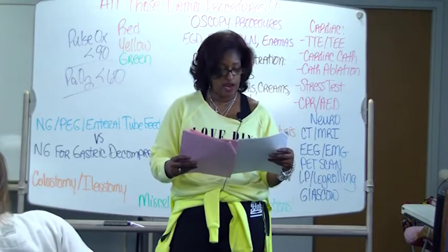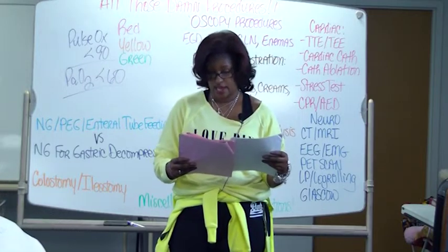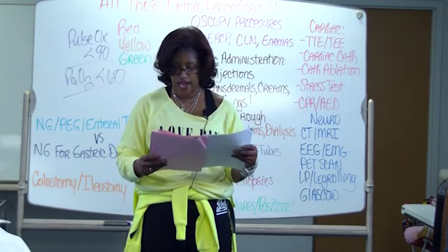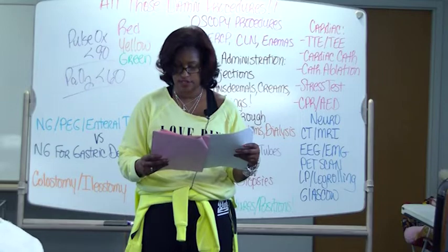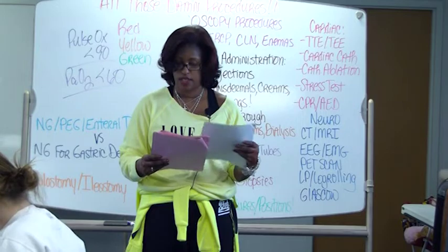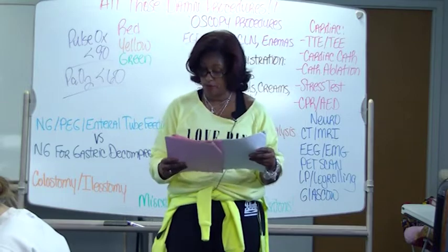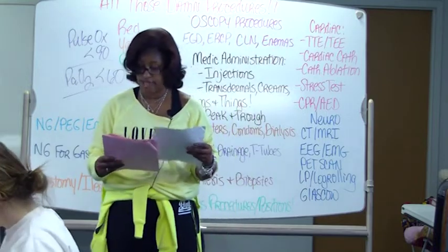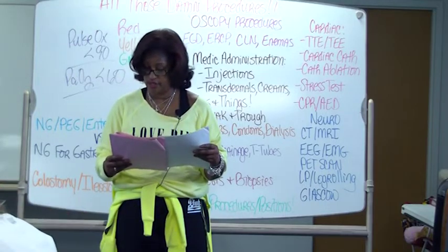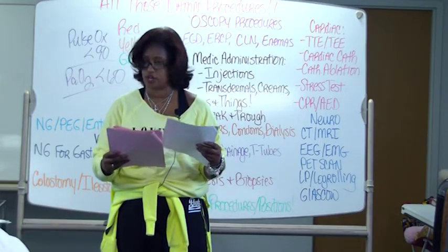Now, if you look at what I wrote on the pink, you can see I wrote some highlights. I wrote, give one medication at a time, crushed with 30 cc's of water. And I put C handout. Then I put don't crush, enteric, sustain, blah, blah, blah. And then I put number one complication of a feeding tube is aspiration. To avoid aspiration, I put aspirate gastric contents, check the pH. So I wrote a lot of things we're going to go over now.